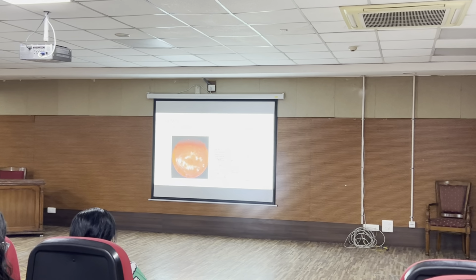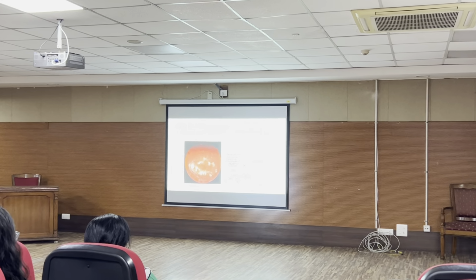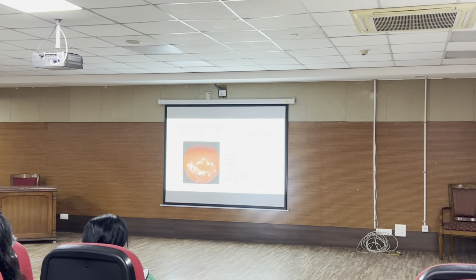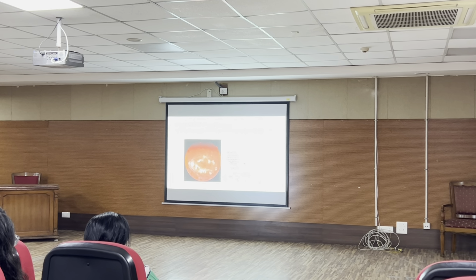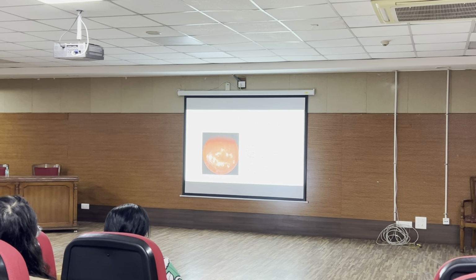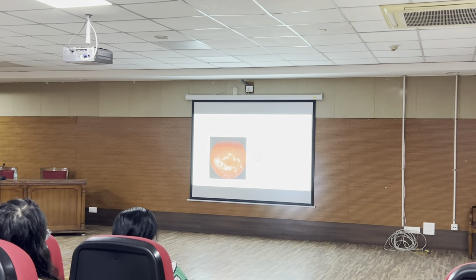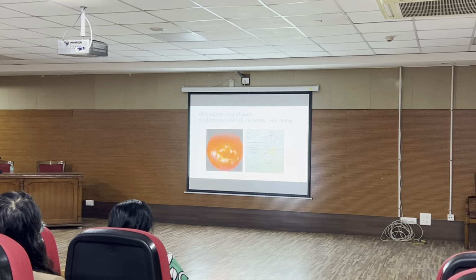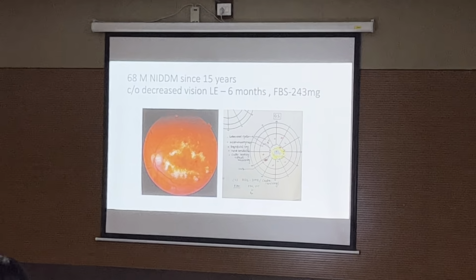I am taking a case of diabetic retinopathy, which is a very common case, and invariably you will get one diabetic retinopathy case in your post-graduation examination. So suppose this is the case you are provided with, and you have to do 90-diopter examination, and then you have to document the findings. So this is how you have to draw the diagram. I have drawn the diagram as if I am a PG student, and this case has been allotted to me. So first I have to describe the findings.